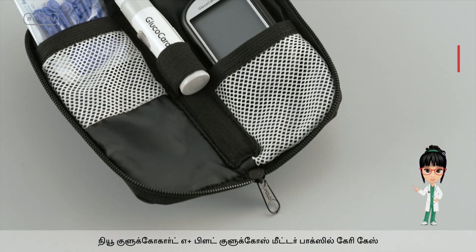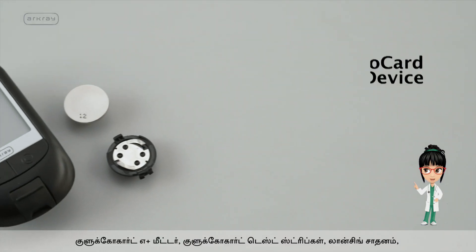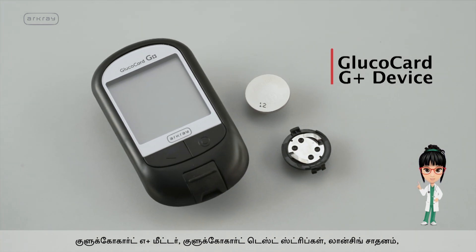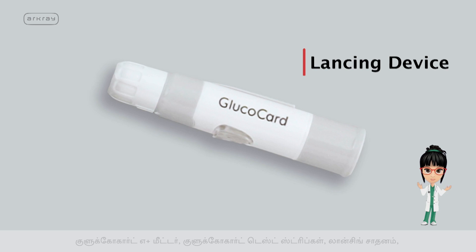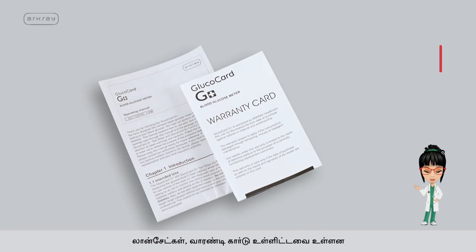The new Glucocard G Plus Blood Glucose Meter box contains an attractive carry case, R-Cray Glucocard G Plus Meter, Glucocard test strips, lancing device, lancets, and warranty card.